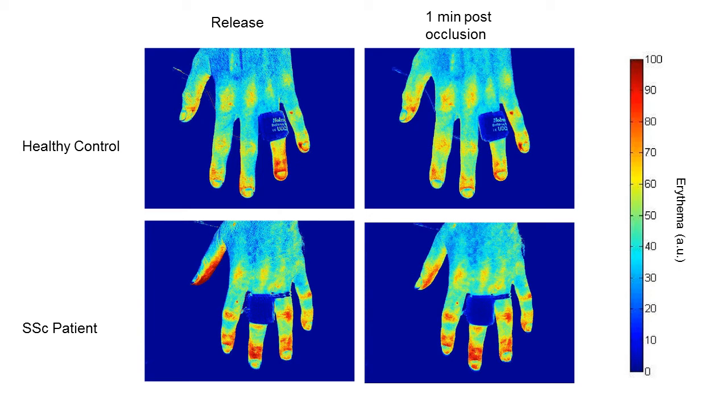For a healthy person, you can see that it's dropped back down to a normal level, and the signal's pretty constant over the finger. Whereas if you look at this, immediately after releasing one of the patients, you've got areas that have not got the same signal throughout the finger, okay? And then this is 1 minute later and there's no real change. So qualitatively, the images are interesting.